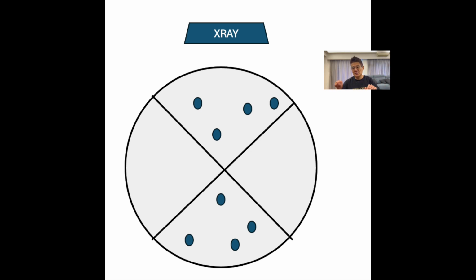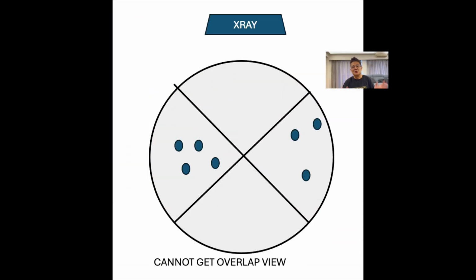And if your wire is in the lateral 2 quadrants of your X-ray tube direction, you're not going to get an overlap view. And this was the limitation that prevented my brain from adopting the idea of moving the X-ray tube instead of moving the wire tip.